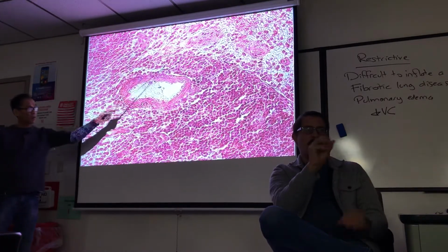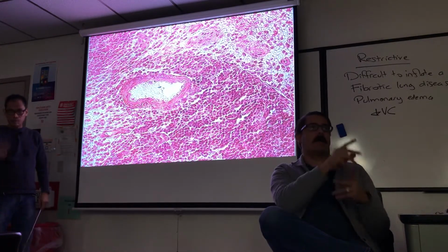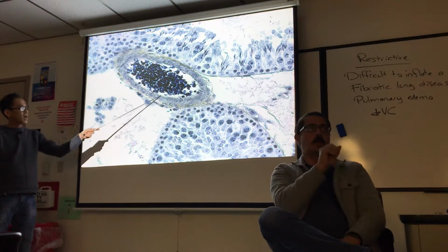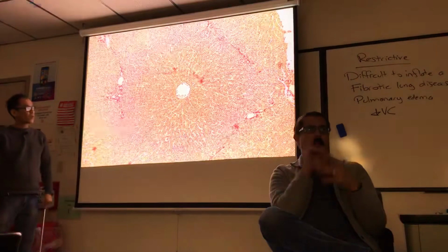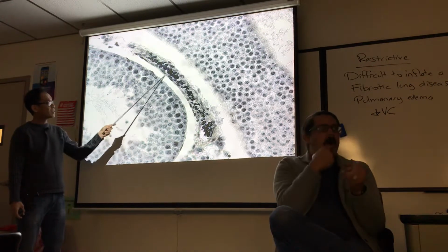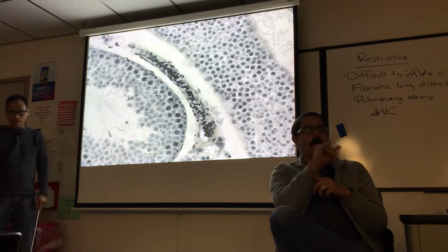And this is a central arteriole from white pulp. But that's the vessel type. Arteriole, two layers. This is going back to a muscular artery. TI, TM, TA, those are red blood cells in the middle there. But I found one on this slide that's barely the width of a red blood cell. I see one tunic, TI, that's a capillary. Capillary.